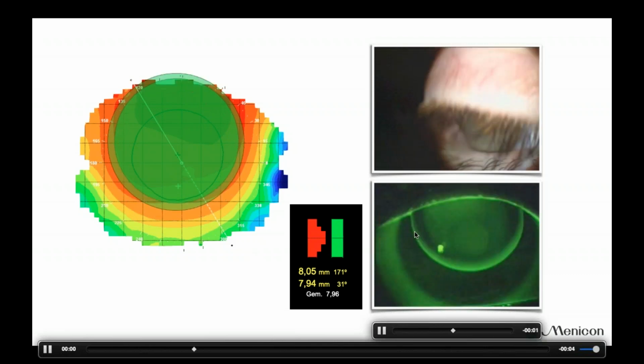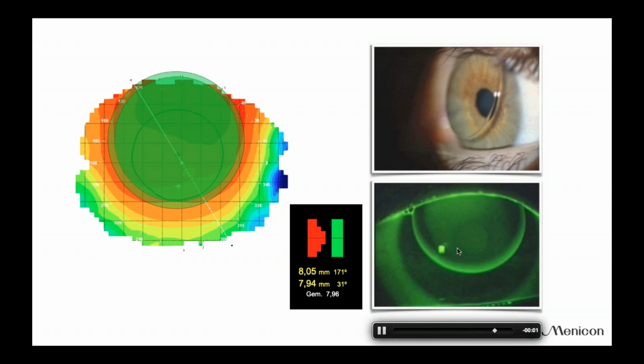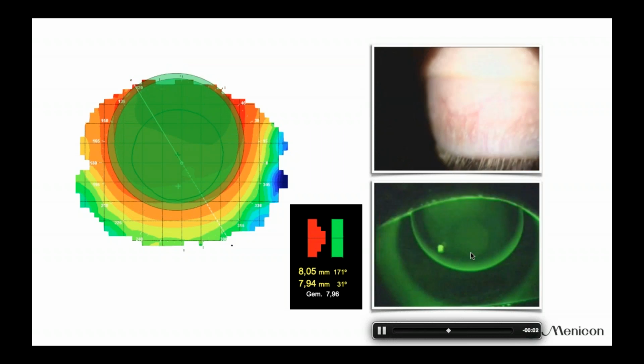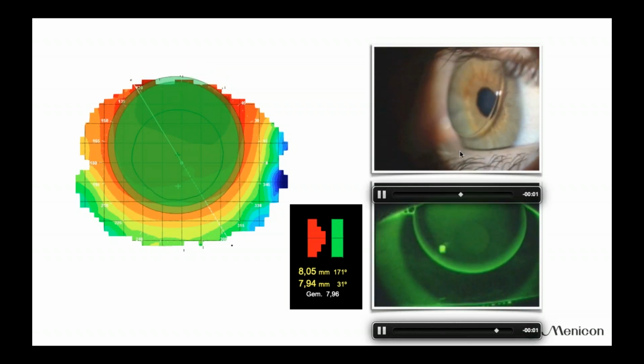What you will see happening in these cases is that people with all the tools try to center the lens with prism ballast or flattening, larger or smaller diameters. They will do everything to get the lens centered. But ask yourself, if you are doing that, are you really respecting the cornea then? That's something to think about, because we have to respect the cornea.